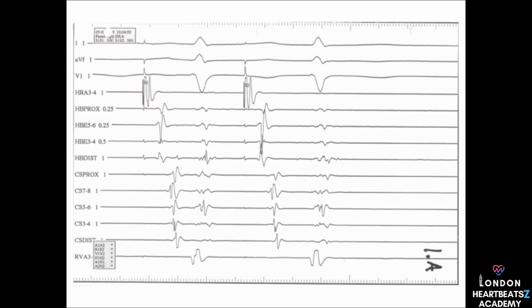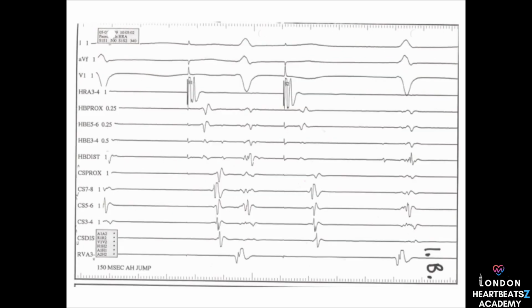Okay, what do those numbers actually mean? The basic cycle length, that's just the regular heartbeat interval. And the S1, S2 interval is the time between the first regular beat, which we call S1, and that extra stimulus, which is S2. We use those intervals to create specific conditions and see what the heart does. So we're controlling the electrical environment to study the heart.